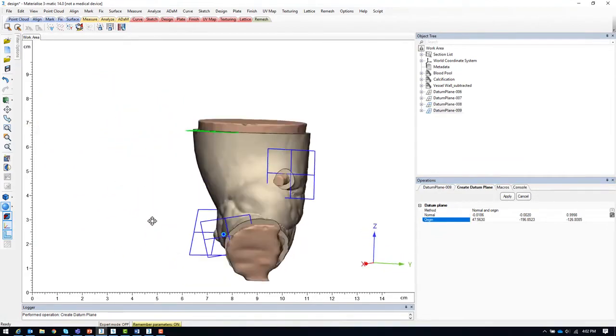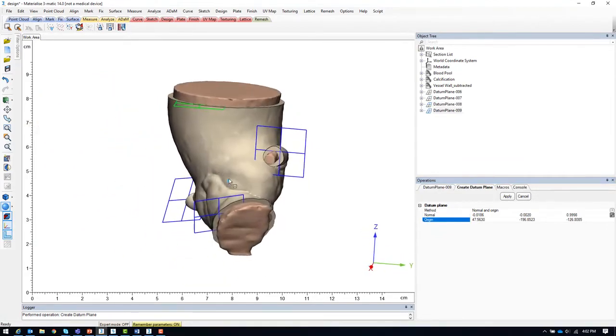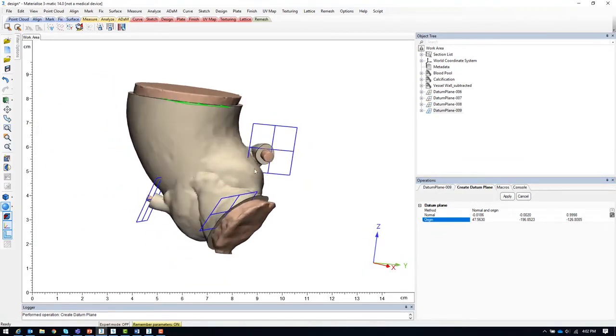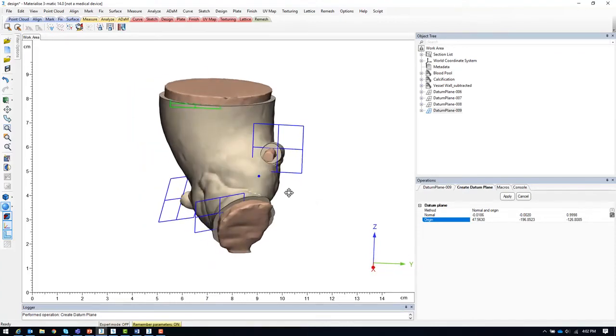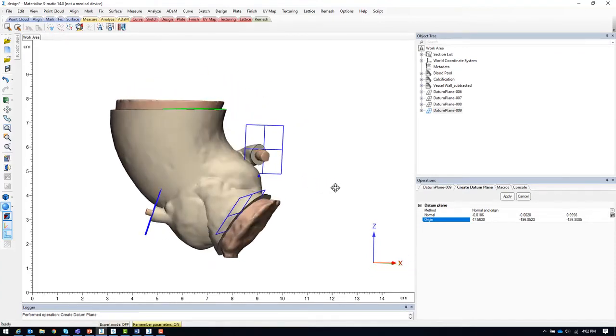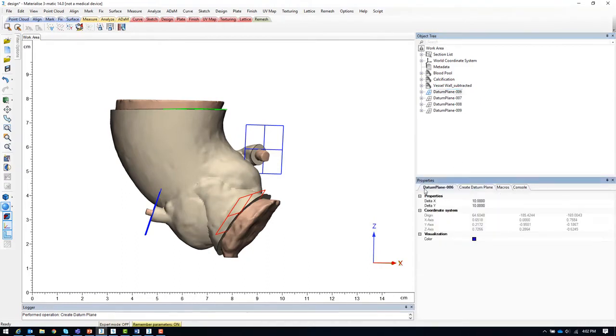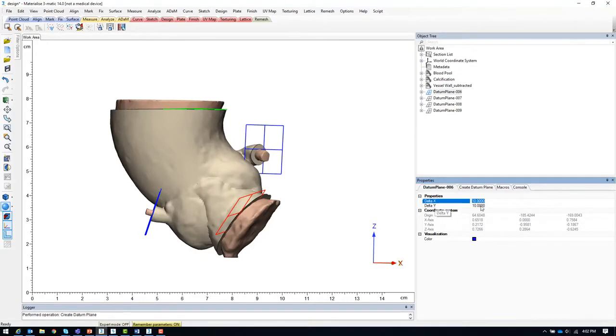Looking at the results, you'll see that some of these datum planes intersect with other portions of the blood pool model that we may not need to cut. So we will need to adjust the size of these datum planes. To do so, select each datum plane and go to the properties tab. You can adjust the dimensions using the delta-x and delta-y parameters.